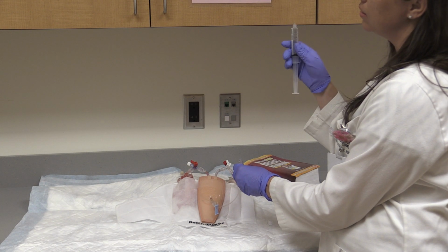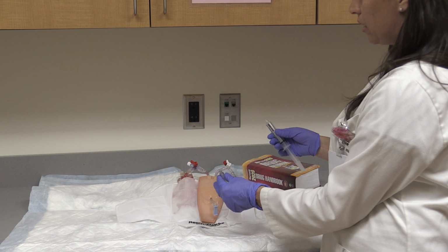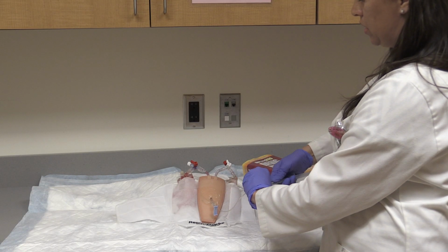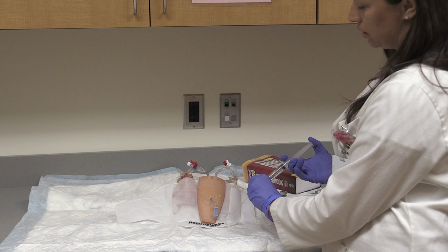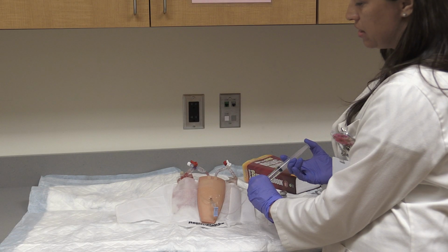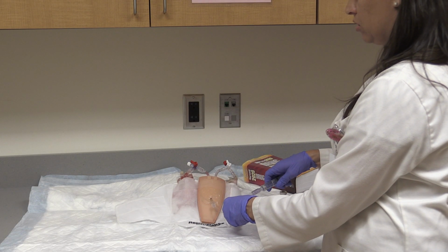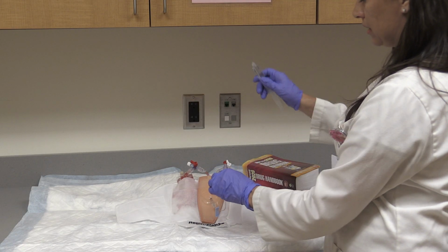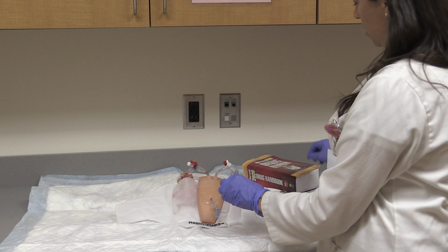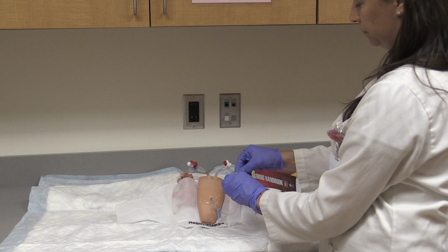So now that the air is out, I've done my third check, which is my scan, and the saline says 2 milliliters saline lock flush. So I've done my third check, and I'm going to attach my saline to my Luer lock, and I'm going to inject 2 mLs of a saline flush. I'm watching the IV site. It's going in great. Doesn't look like there's any signs of swelling or infiltration. So I'm going to disconnect that.